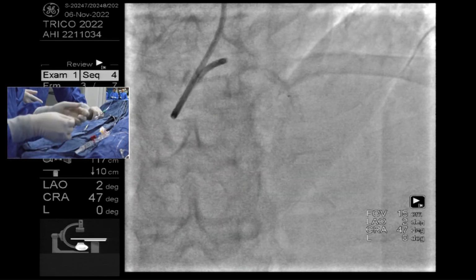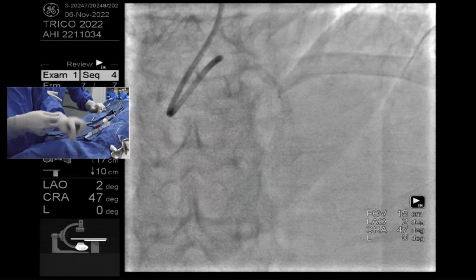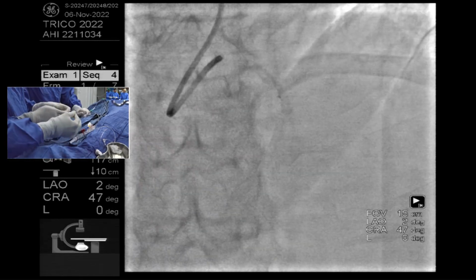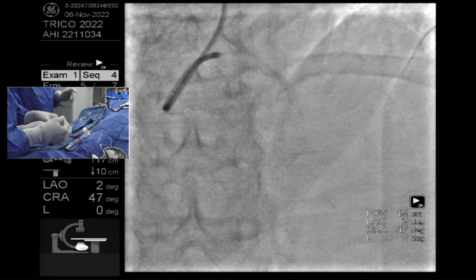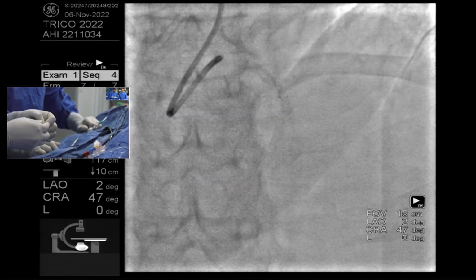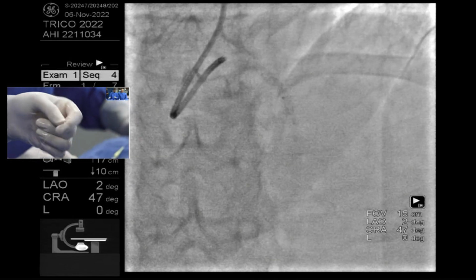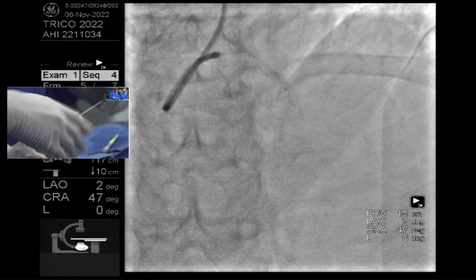And see, Sanjay will be, I think, giving only the primary curve for this, nothing else. Very, very modest primary curve. Has the microcatheter come out a little bit or is it the same? Let us see. Let's go.